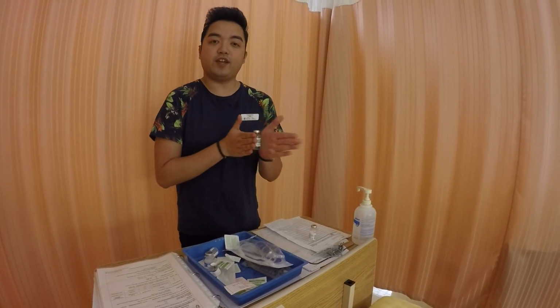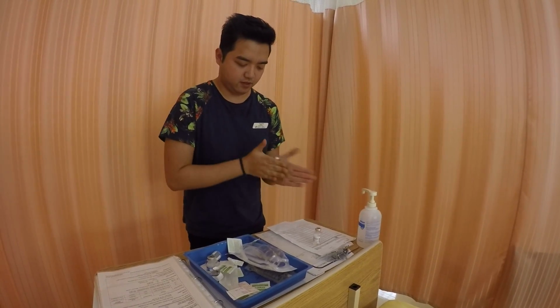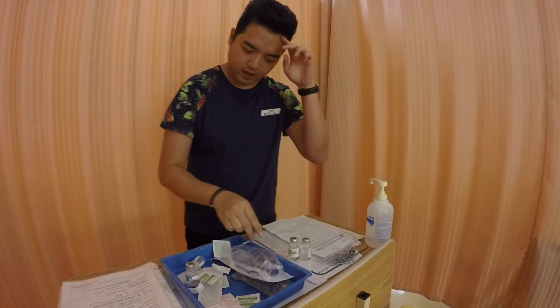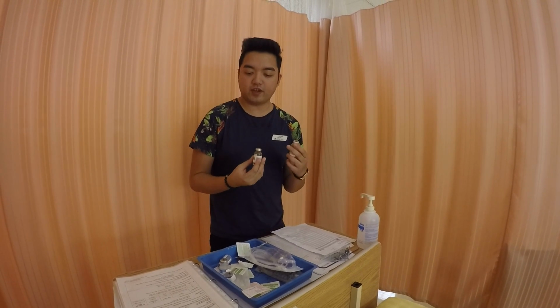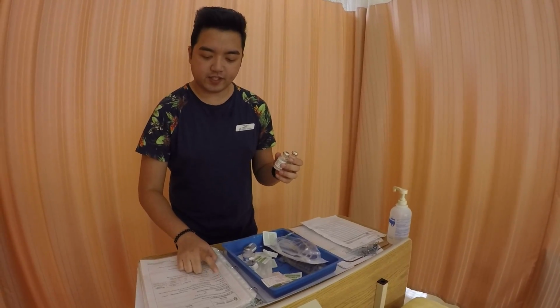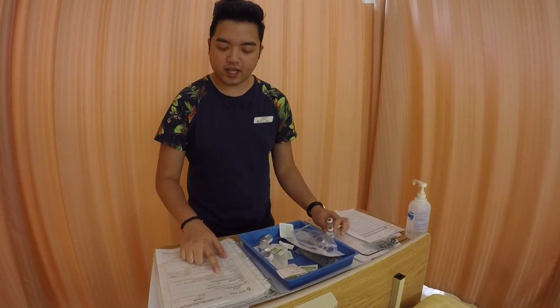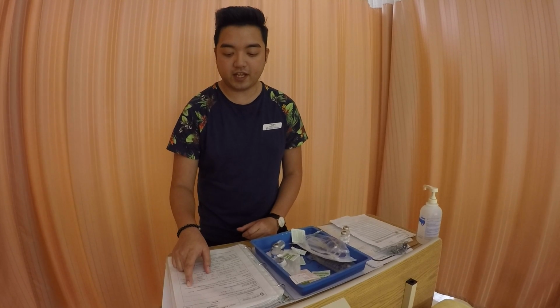Okay, gently roll between our hands just to make sure everything is mixed. Okay, there you go. And then now that we have everything in here, since we want to give it IV, we just need to make sure that we check the drug monograph again. So it says here on the drug monograph to dilute the medication in a 10 to 100 ml D5W, normal saline, lactated Ringer's, or dextrose-saline combination and administer over 20 to 60 minutes.